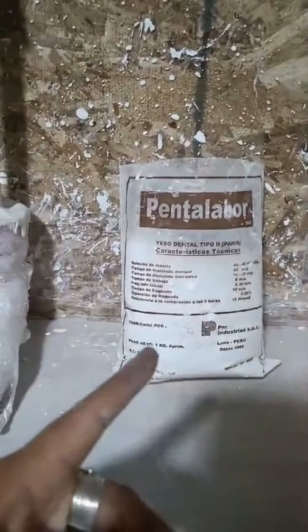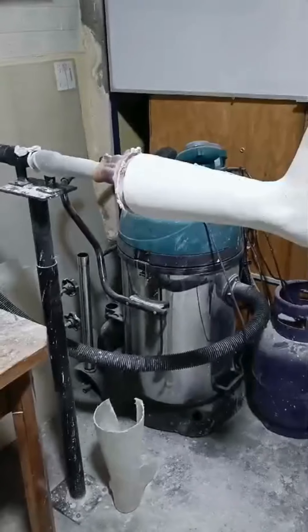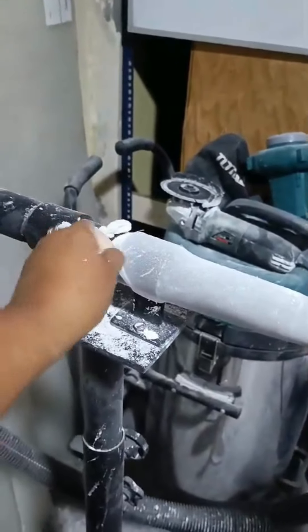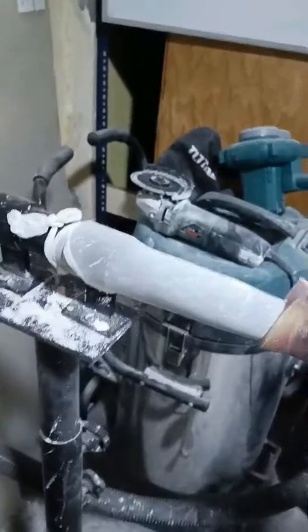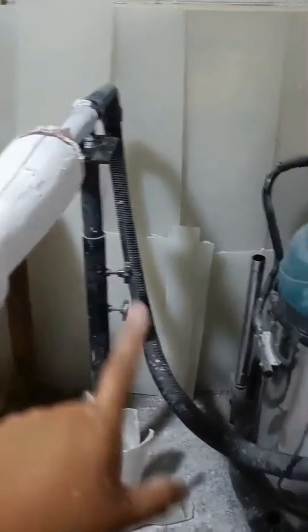This is the cast powder that I use. Then it goes to this — we suck it. I use nylon panties that I cut. This is the suction machine.